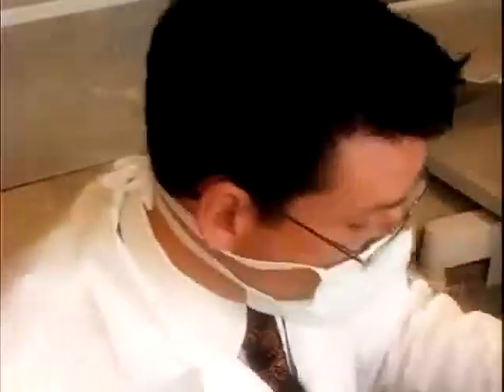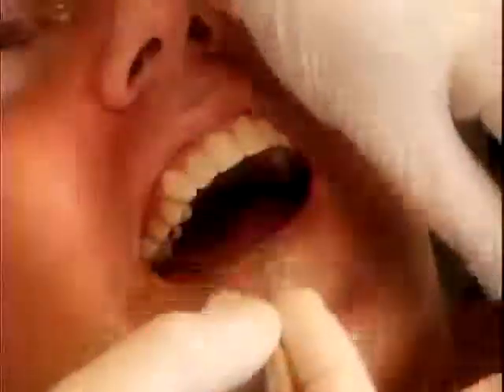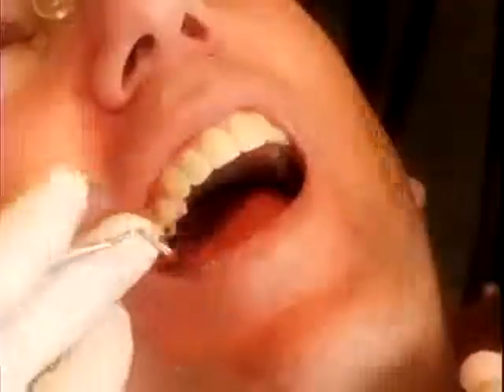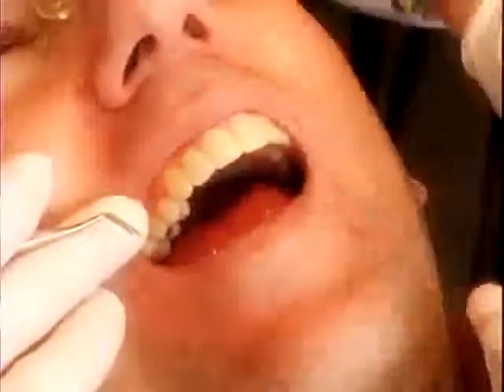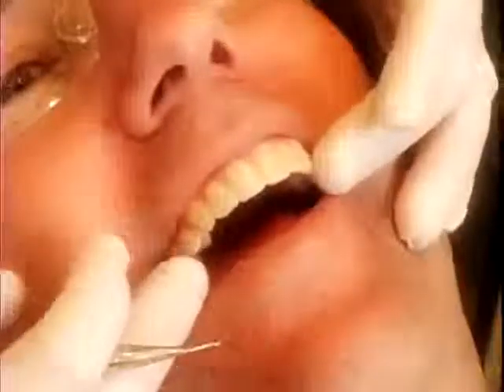So here's the sad part. We're going to be taking these off now. I'm going to start by putting a little pressure on them. And what you'll be doing, unfortunately, in just a moment, is seeing your before one more time. As I'm removing these, you can see how I've increased the scale of the tooth structure, and I've closed out the spaces, and we now have uniformity in color throughout. I'm actually going to have Randy take a look in the mirror as we do this so he can see the changes that are going on and understand the steps that we're taking to create change.